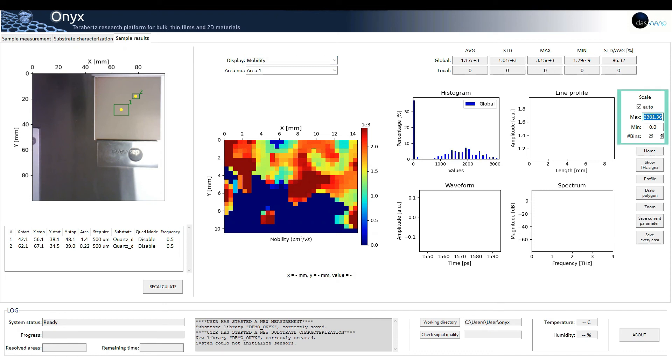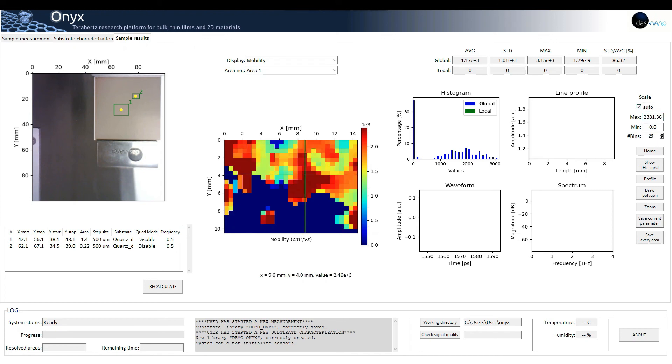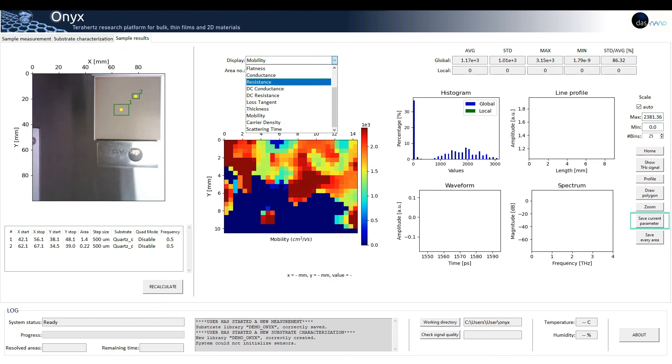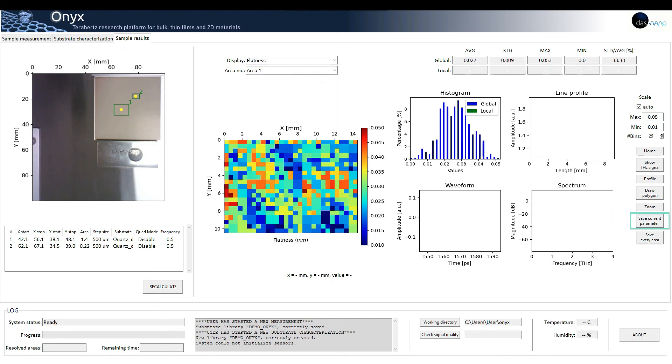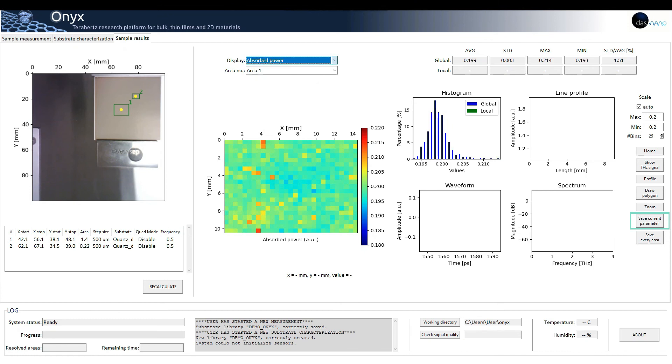The scale is automatic by default, but the user can modify it. This facilitates the subsequent comparison of various graphs, since the system allows the user to generate and export them with the desired scale, avoiding further processing with other software. Each map can be saved at the desired scale using the save current parameter button.